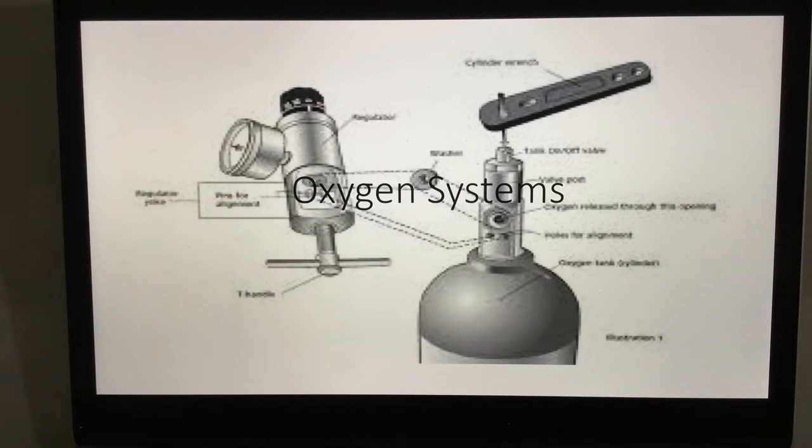The tank has a color scheme that is usually green or green with silver. It has a special placard on it with a yellow diamond that says oxidizer or oxygen, and that label should say USP.